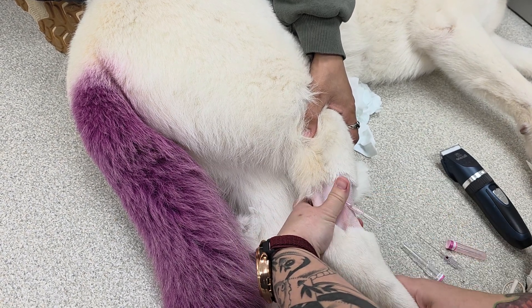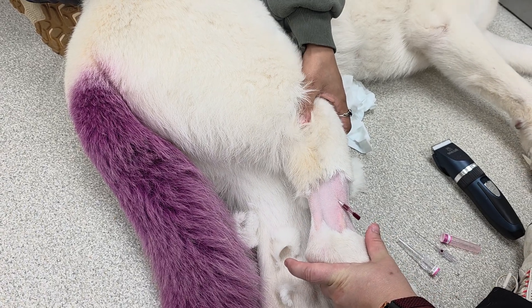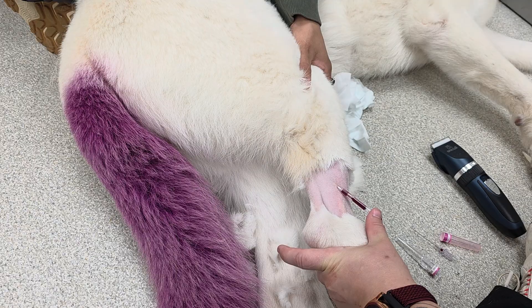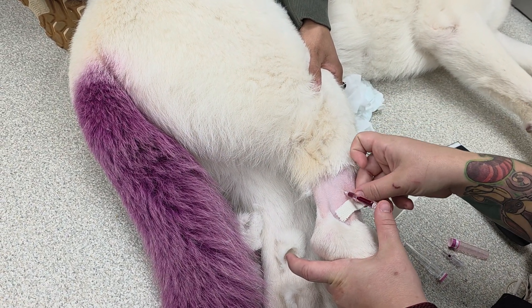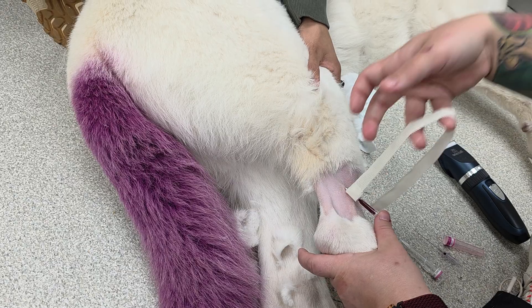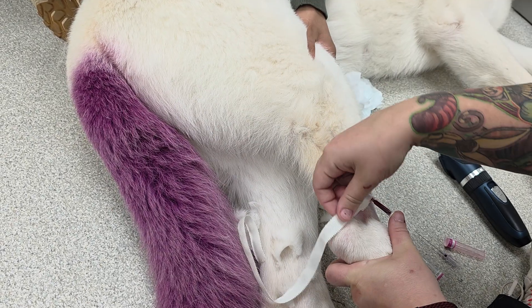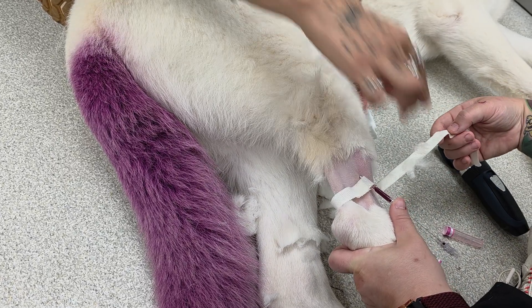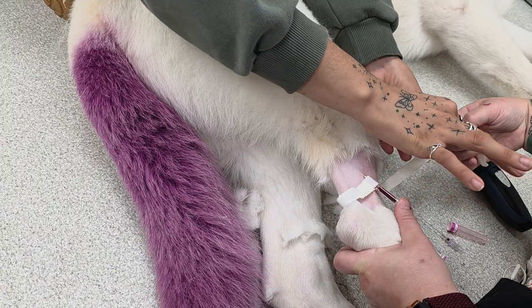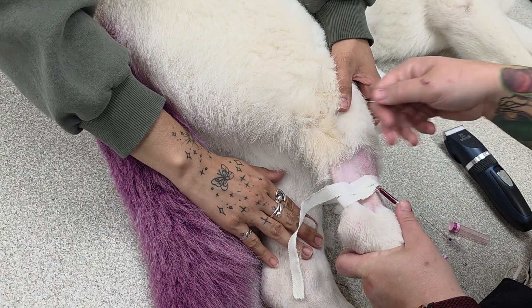Then you'll cap off. And here's where you tape. Can you get that hair off? Thank you.